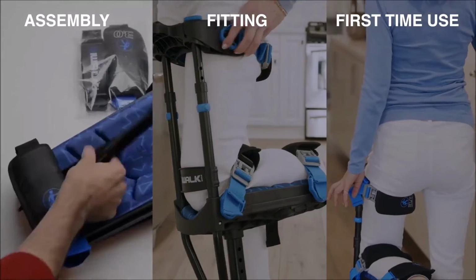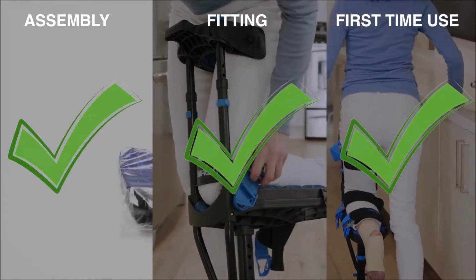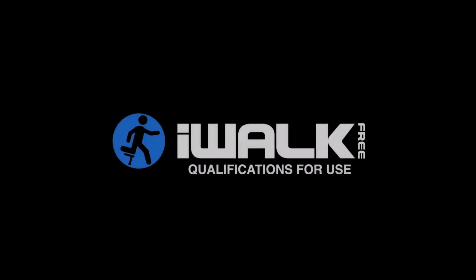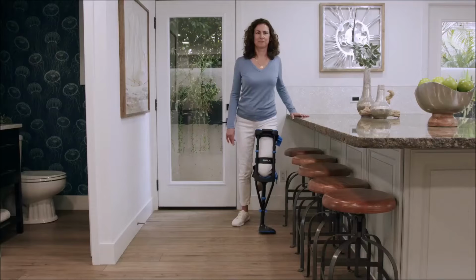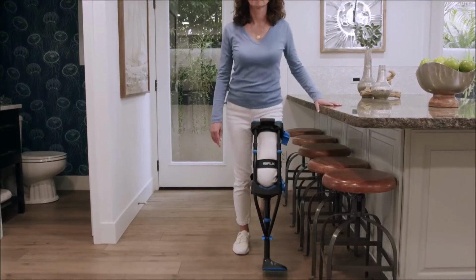And finally, you're willing to watch all of our instructional videos before you use your iWalk. These are just the basic requirements. If you're in doubt or have special circumstances, be sure to consult our full listing of requirements for use. Understand that everyone adapts to the iWalk at their own rate, which can range from 5 minutes to several hours.